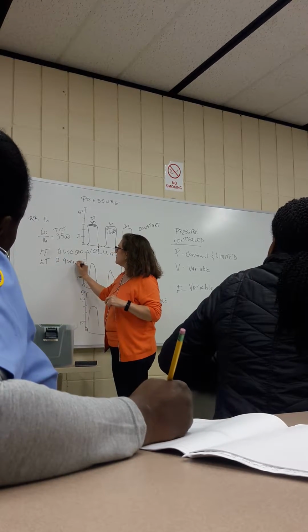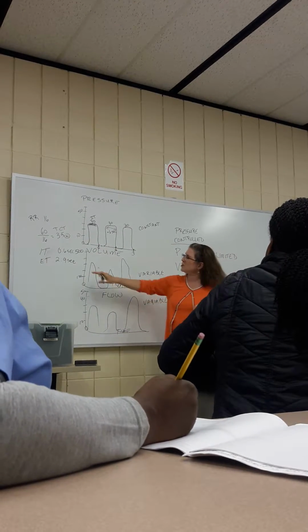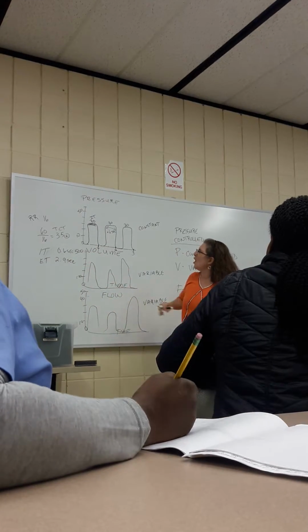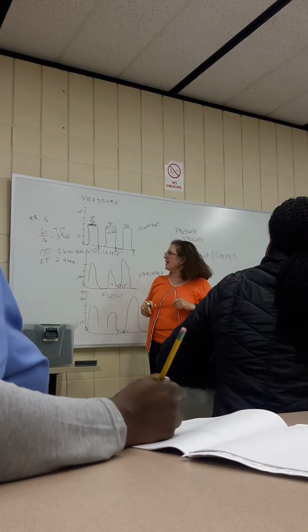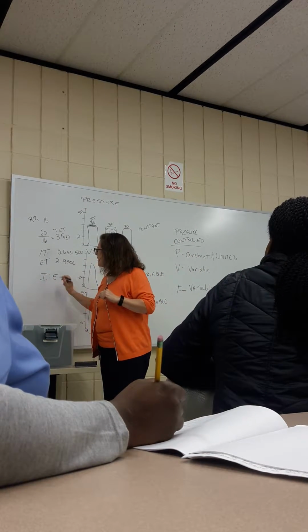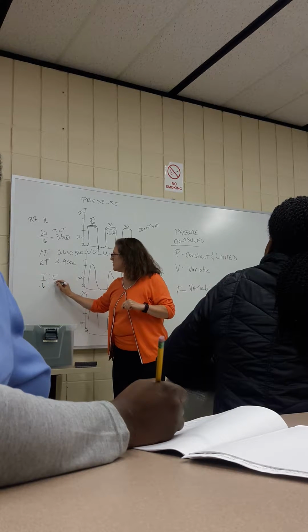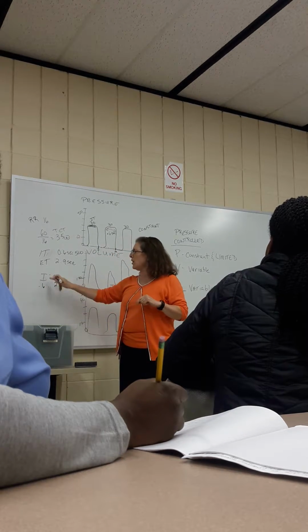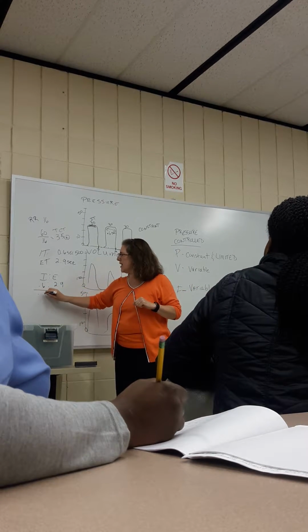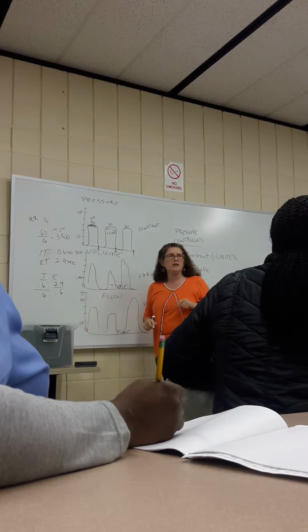2.9 seconds. Okay. Because 2.9 plus 0.6 is 3.5. Sorry, that says 3.5. Okay. What's my I:E ratio? Okay, so we're going to go 0.6 is to 2.9. We want to get this to be 1, right? So we'll divide that by 0.6, and we'll divide this by 0.6.